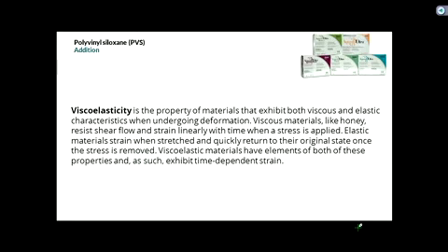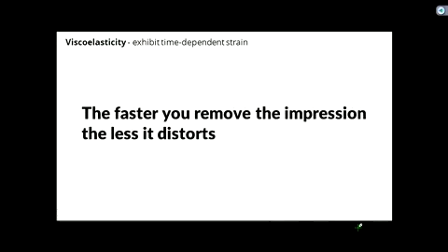No. But the idea is that PVS is a material that is both viscous and elastic. So what I need you guys to know about PVS is that it's time-dependent strain. Yes, it'll flex back because it's an elastomeric material, but it's also viscous in the sense that the faster you remove the impression, the less it distorts.